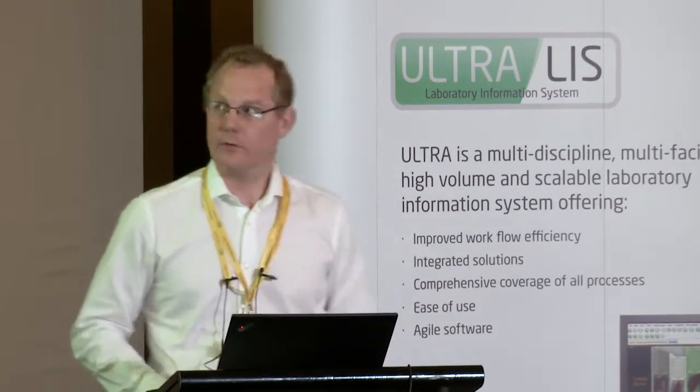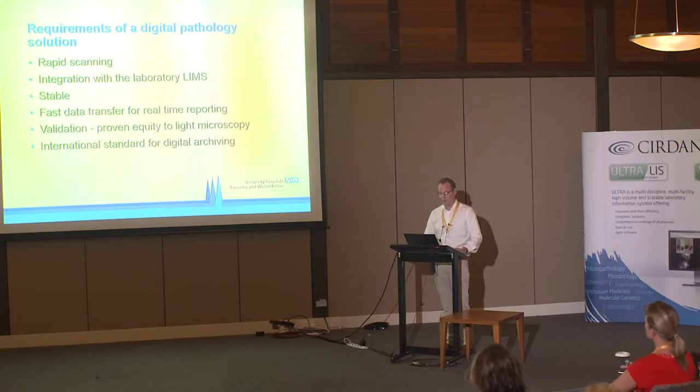At the stage we took this project on, this validation step had not been completed. In other words, nobody had adequately demonstrated that pathologists are as good on digital systems as they are with a conventional microscope. So it was an important part of our project to do that.